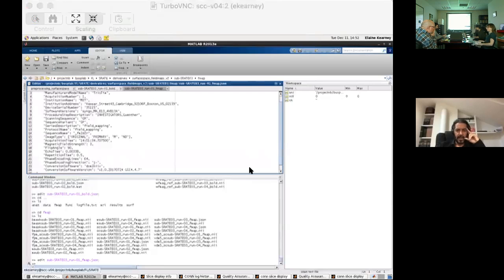And all of this data has been unpacked with the DICOM to NIfTI tool. Oh, it hasn't. Okay. So perhaps the latest version has some additional information extracted when encoding. It's definitely worth a try as well. Yep. That thread I can send you.